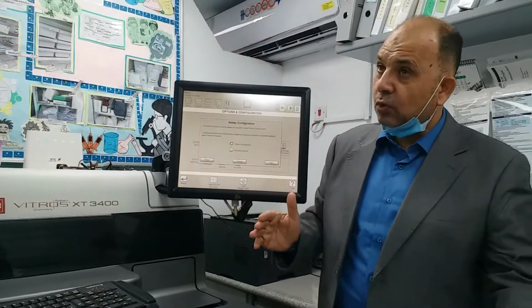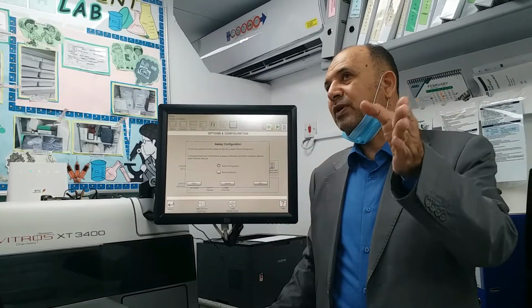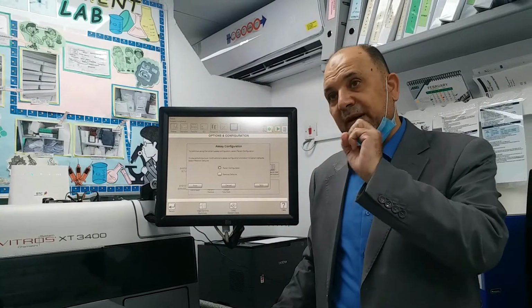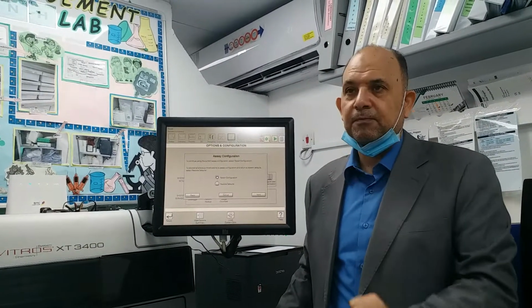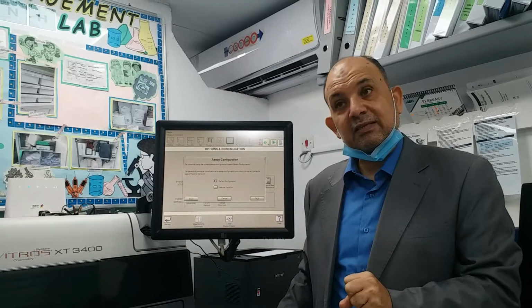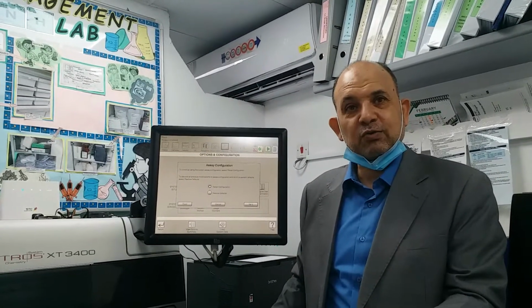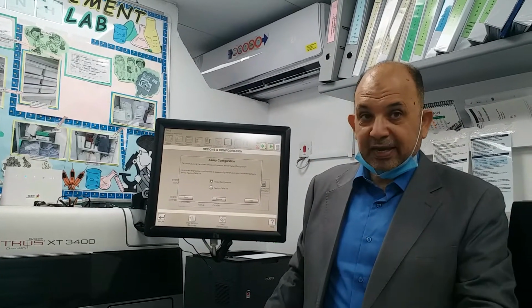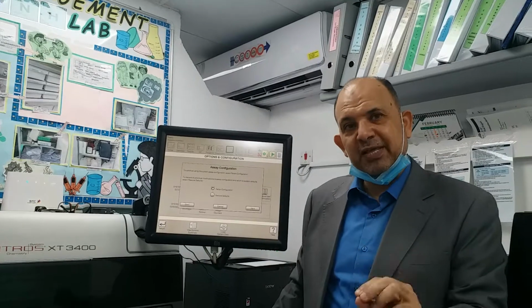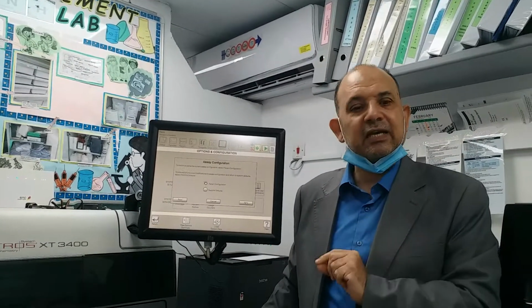The same applies to the low reading. If the low reading starts from, say, 20 up to 400, for some parameter, and I find that my machine is reading from 30, can I keep it like that? The machine will not read the first point which I want to test. According to that, I have to reduce my beginning point, or the minimum reading of the analyzer, from 30 to 17 or 18, like that.